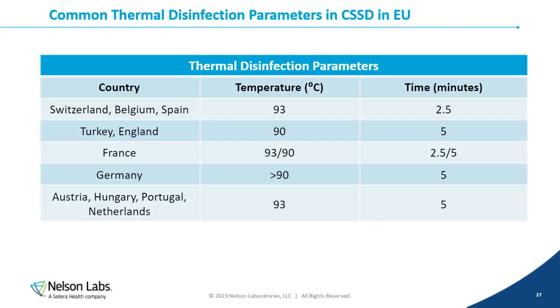So these are some common thermal disinfection parameters you'll see coming from Europe. They're really based on what country you're marketing in, which will determine what thermal disinfection you have in your IFU.